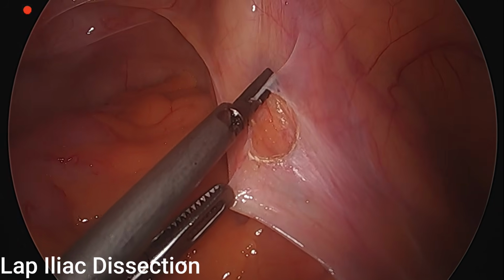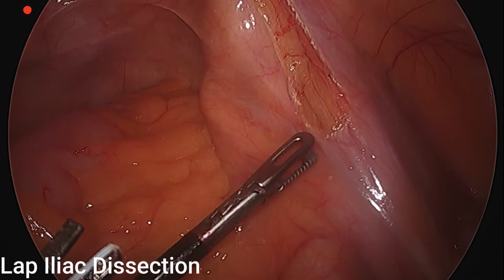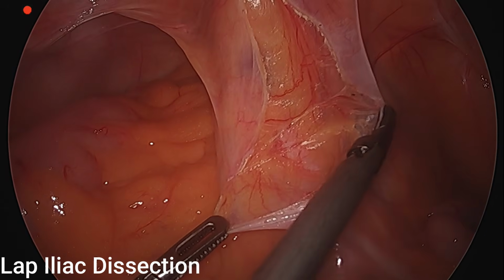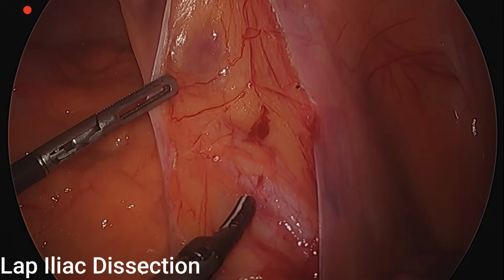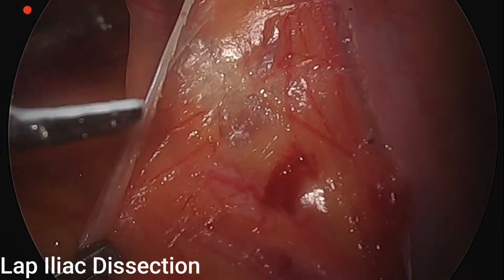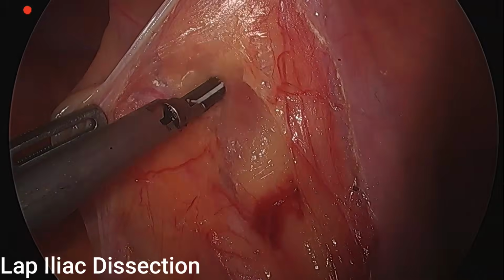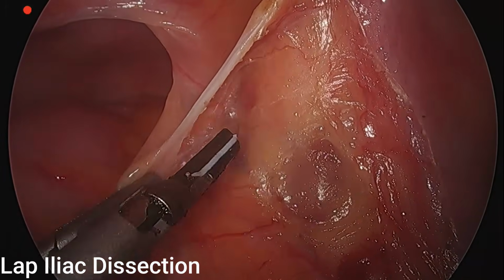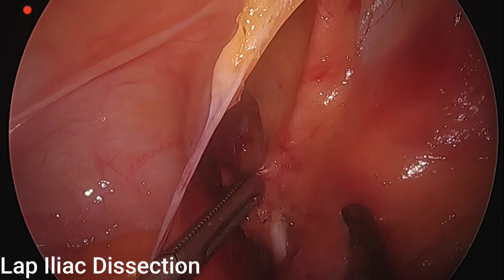A peritoneal incision is made along the external iliac vessels, which is extended proximally and distally to expose the first structure along the medial leaf of the peritoneum, which is the ureter. Once we identify the ureter, which is one of the important structures in the iliac block dissection, we medialize the structure and completely expose it distally so that it never comes into the field of dissection. All the fibrofatty tissue is lateralized and the ureter is medialized. Once this is done, you can clearly see.